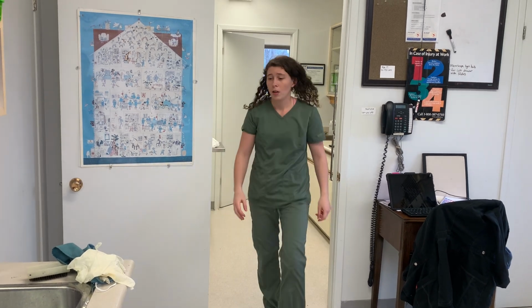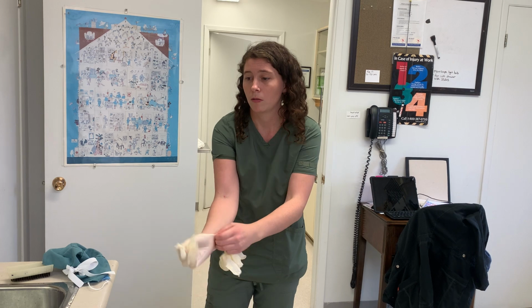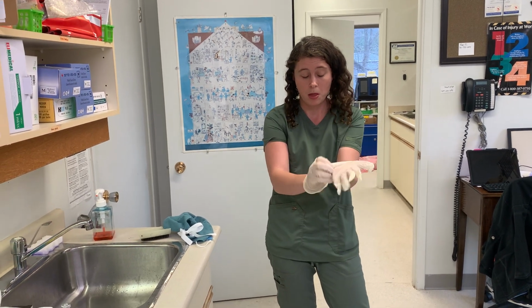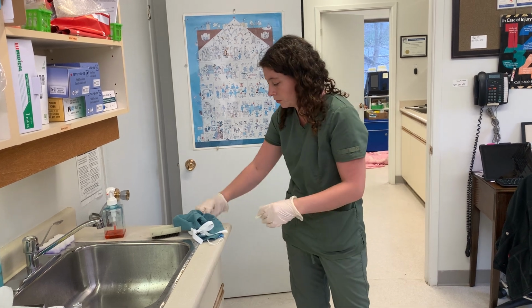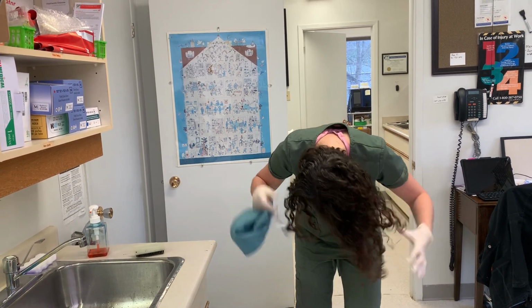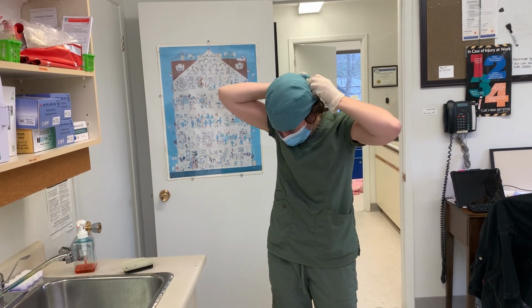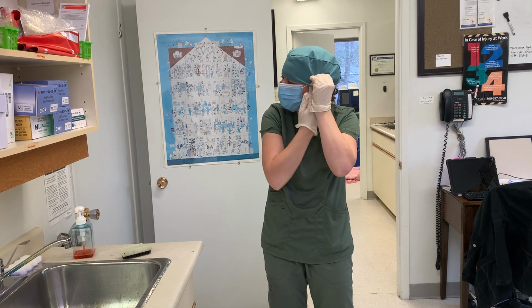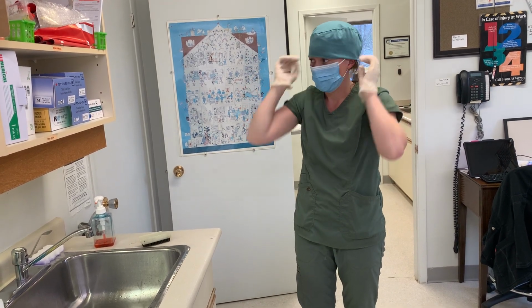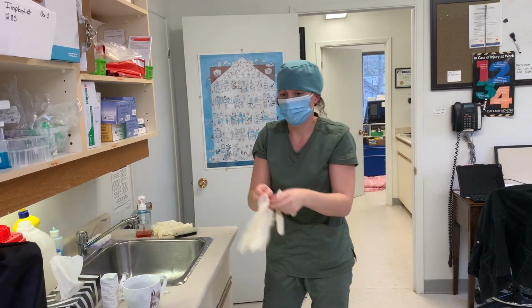Okay, now that that has all been complete, I need to make sure that I do a couple of things here. I'm going to put my gloves on. So gloves are going on, and then this glove on. Put my mask on, and then I need to put my cap on. Now I'm going to make a choice here to put another pair of gloves on because I touched my own hair. So it would just be smarter to use a new pair of gloves.